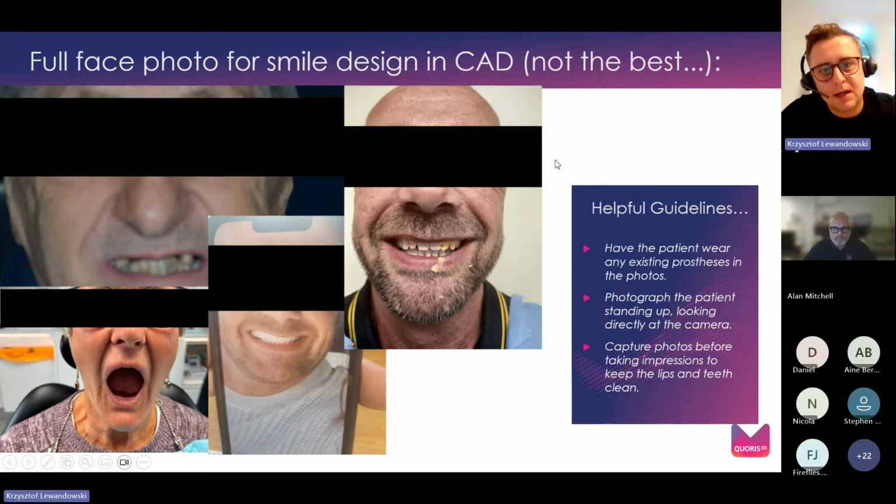From the other side, I prepared for you also photographs which are not the greatest, not the best record of the patient photograph. We can't really work with blurred photographs. If we have a denture-wearing patient, as I've mentioned, it's important to provide us the pictures with the denture in the mouth and without the denture.